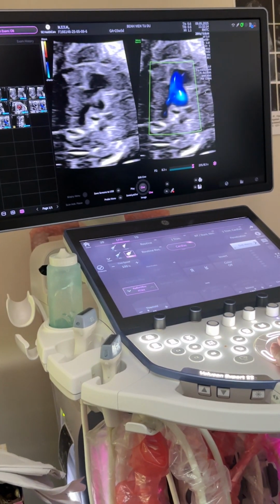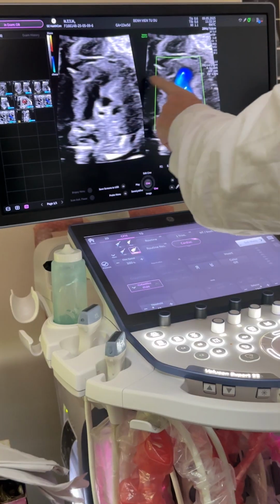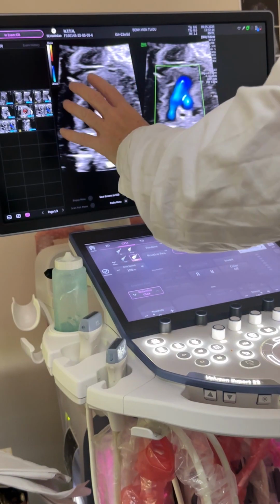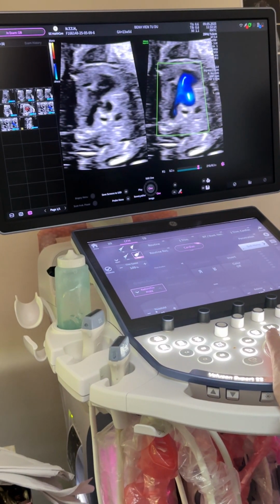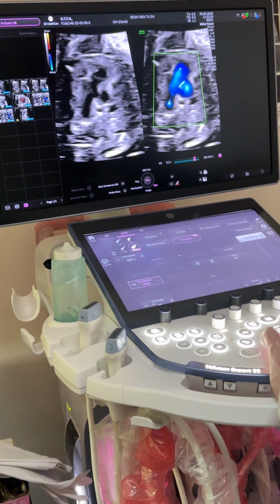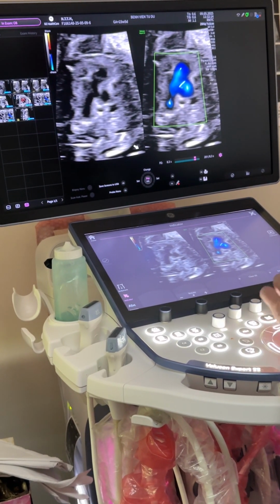Okay, breathe away normally. So when I look at this vessel, I see on 2D, and I see my color representation. And I want my color to represent what I see on 2D, because sometimes we use too much color and we have too much fill. But I can see that that is good. I have adequate representation of the fill of the vessel on that image. There is no pulmonary valve stenosis, and I have a normal trachea and I have a normal SVC.